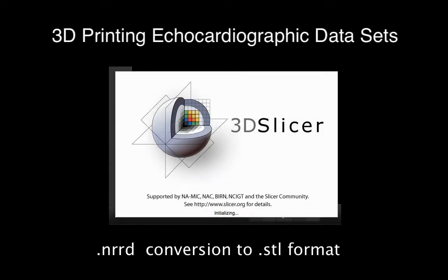3D Slicer is a free open source program that can be downloaded from www.slicer.org. Slicer is a powerful and complex program that can take some time to learn. The following description is the process that we use and is not the only path in Slicer to generating an STL file suitable for printing.